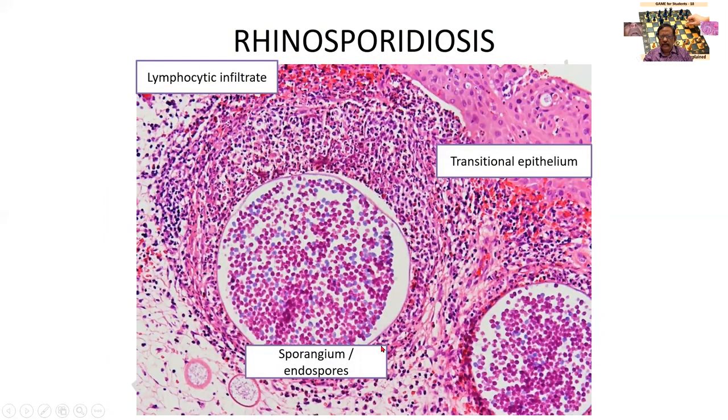This is a slide that will definitely be kept for the examination. Kindly follow it. In this one, I am finding an epithelium. There are two types of epithelium. One is the columnar epithelium. Another resembles a squamous epithelium. That is called a transitional epithelium. Normally, we think transitional epithelium is present only in the urinary bladder, but here it is a transition from one type of epithelium to another, and hence it is called transitional.